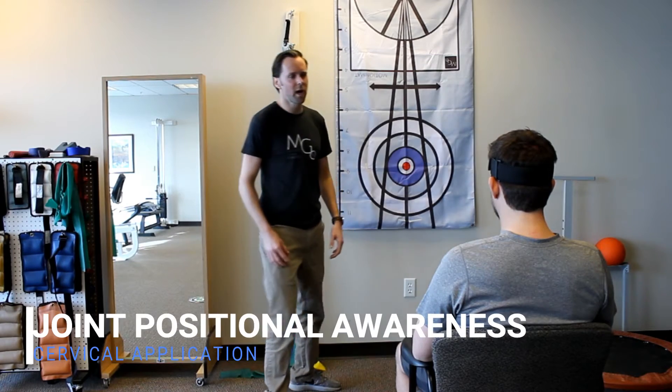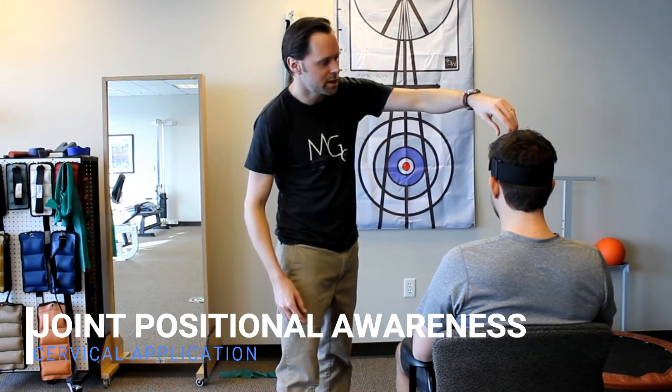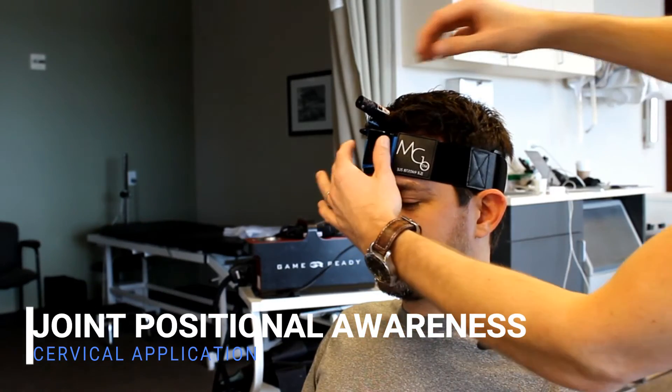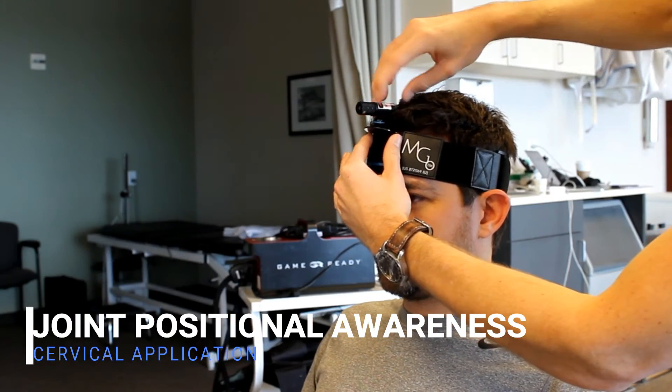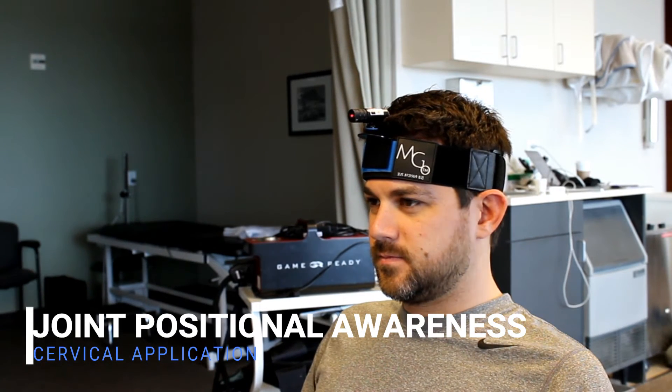We've got the large strap, a perpendicular mount with a laser attached to it. We're going to turn that on and center that up. Do you feel like you're facing straight ahead at that target there?